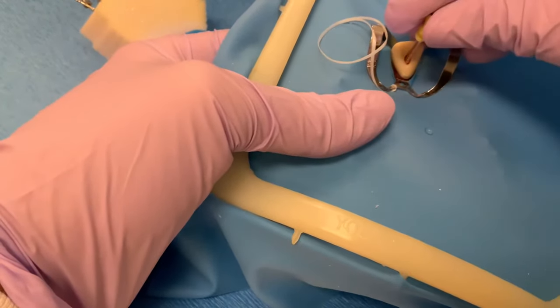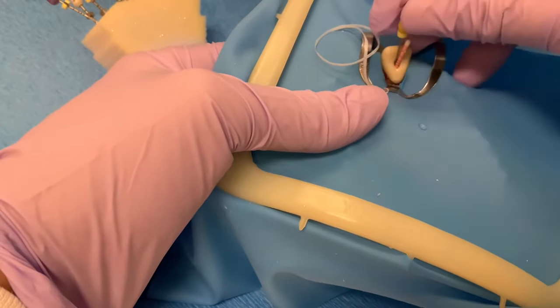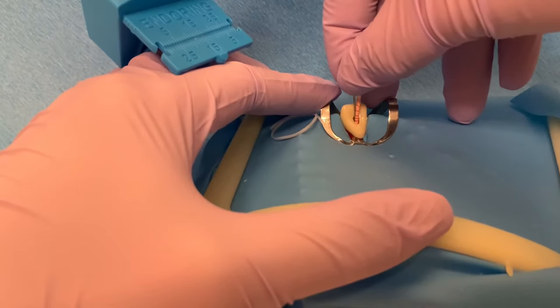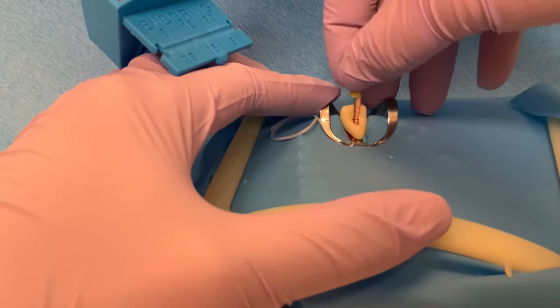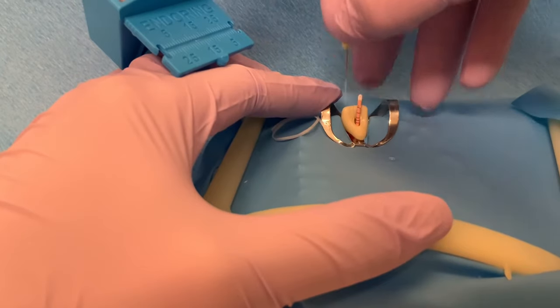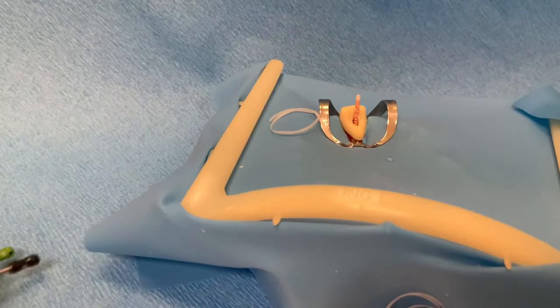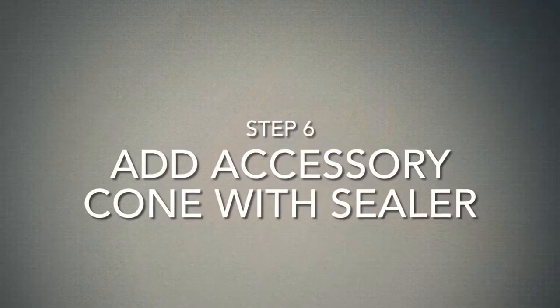Insert the finger spreader into the canal between the master cone and canal wall. Apply gentle apical pressure, holding for 2 seconds. Then apply lateral pressure to push the master cone laterally. Finally, wiggle and rotate the spreader before removing it from the canal. This motion pushes the gutta percha laterally against one wall to create space for an accessory cone.